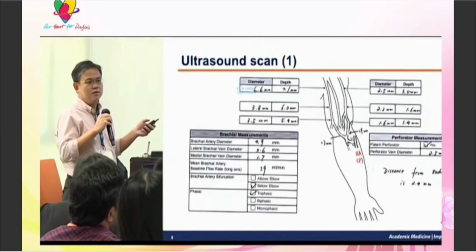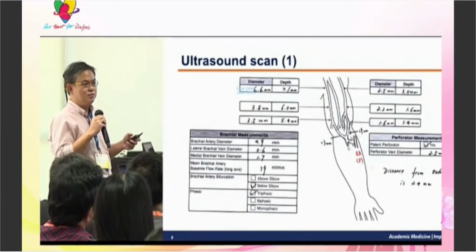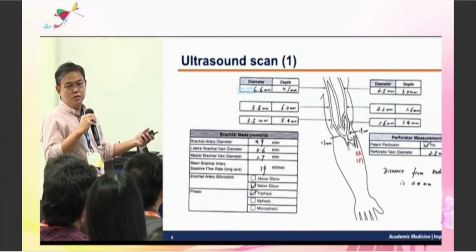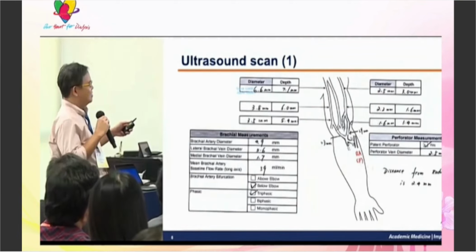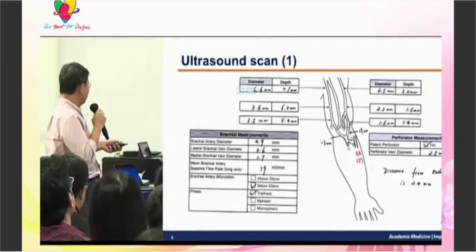This patient should be eligible for a WavelinQ system. But do you really want to do a WavelinQ system? Because the outflow vein is good, but even if you do create an anastomosis, the fistula is not going to mature. So in retrospect, we shouldn't have done it, but we did it. I will show you the consequence of that.